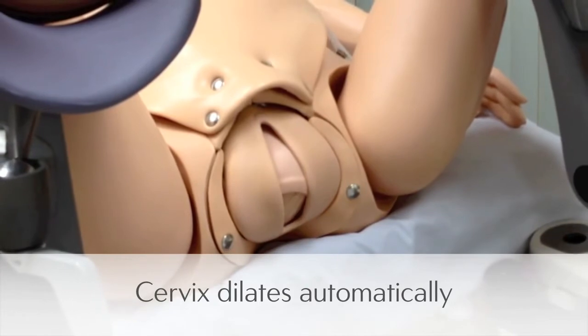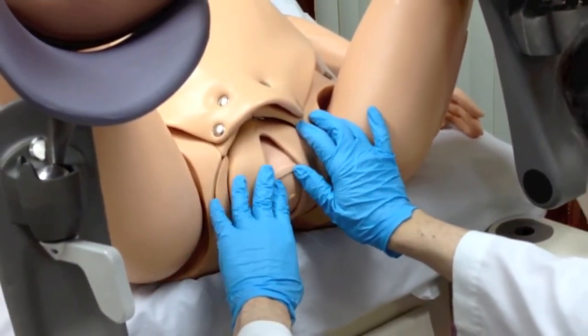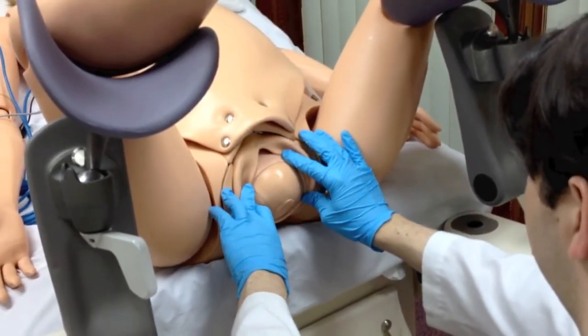NOEL's cervix dilates automatically as the fetus moves down the birth canal, starting out at one and a half to two centimeters and dilating as the baby progresses down the birth canal.